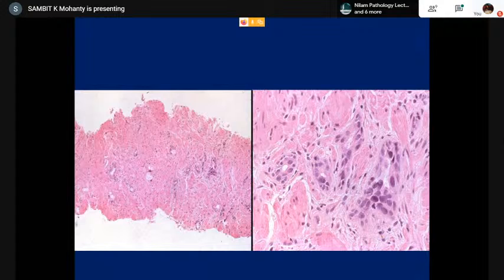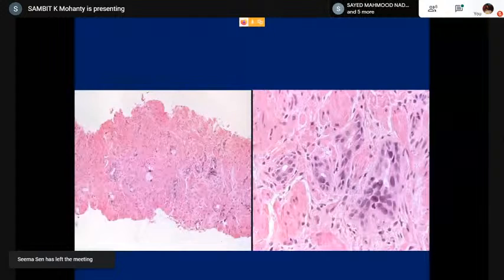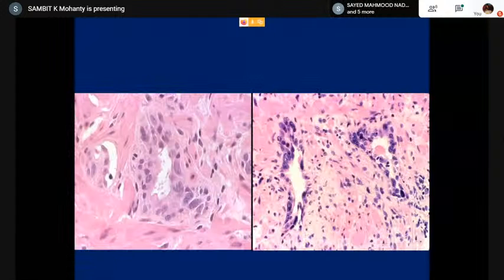Like in other organs, you see all these things, and you have to be careful of these changes and make the right diagnosis. And you see a lot of desmoplastic reaction, reactionary fibrosis, reactionary fibroblastic and myofibroblastic proliferation. In that case, some mast cells would be there. Don't be confused, because it is all desmoplastic. Remember, prostate cancer does not show desmoplasia.